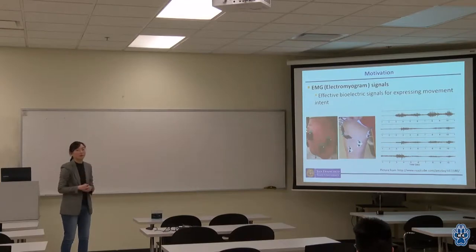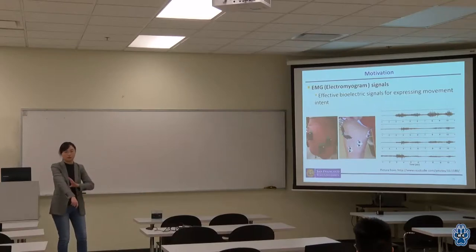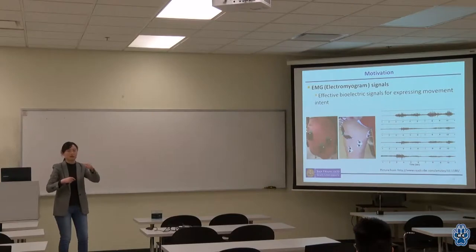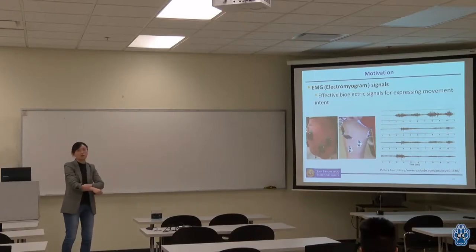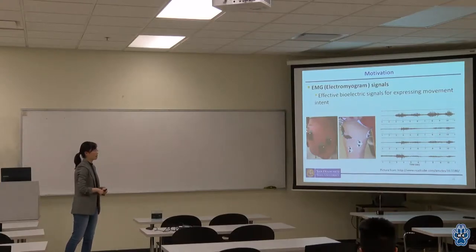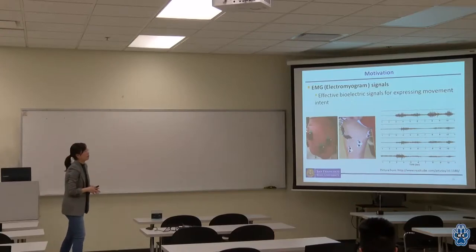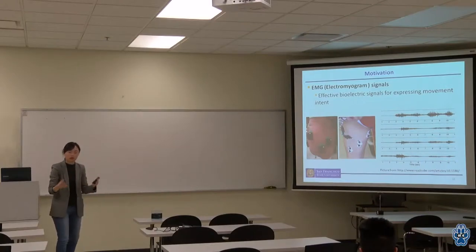The device you just saw is basically a device that can collect EMG signals from the user's forearm. We can just easily slide in this armband, and there are 8 sensors. If you look at the inside of the armband, those metal parts are electrodes. They have to touch your skin, and when you perform different gestures, your muscle activities will be captured and measured as EMG signals, and that's going to be sampled by the analog to digital converters of the microcontroller built inside that Myo armband, and then we have different algorithms to interpret this data to identify the user's intended motions or gestures.